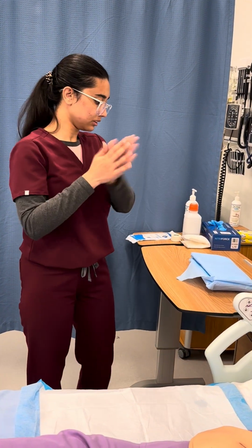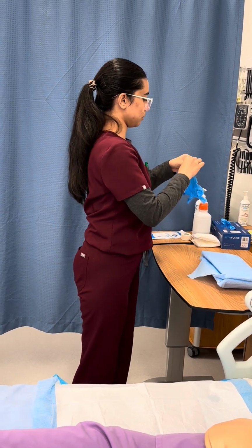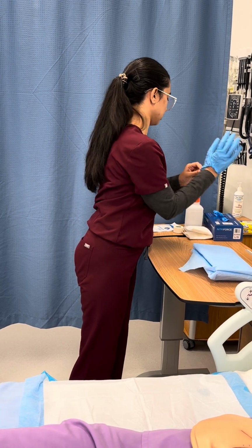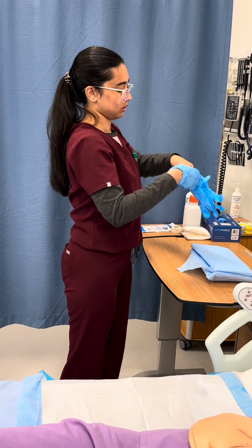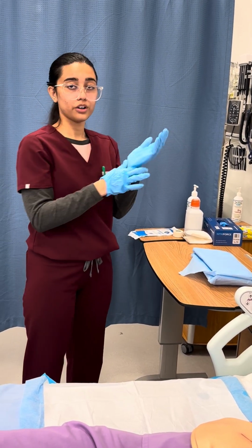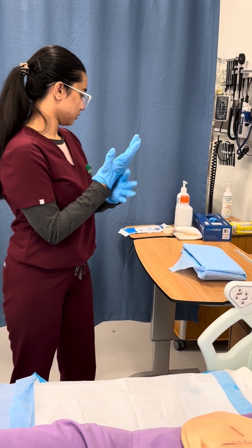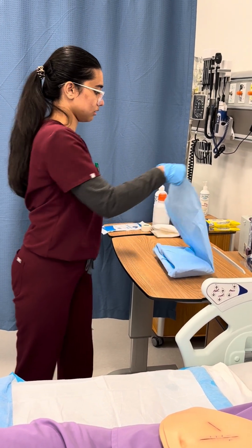Perform hand hygiene. Put on clean gloves. I've already maintained the sterile triangle as mentioned before. So now I'm going to open the kit away from me.